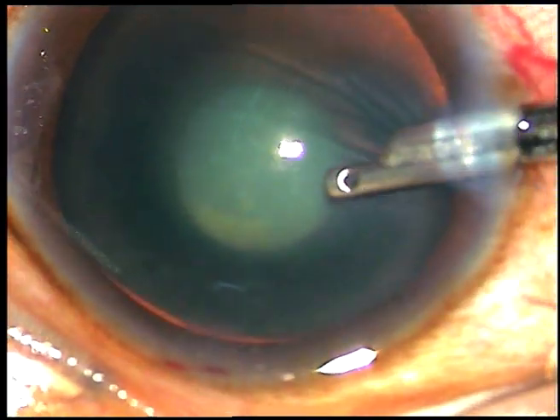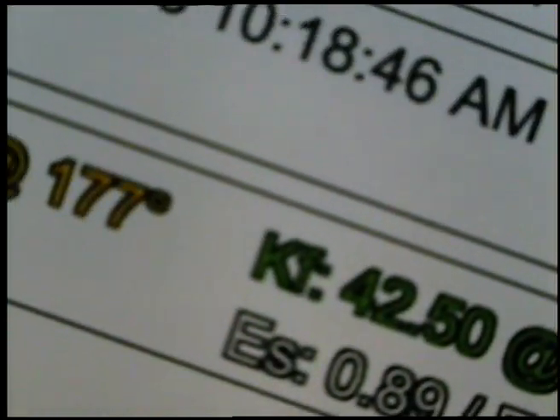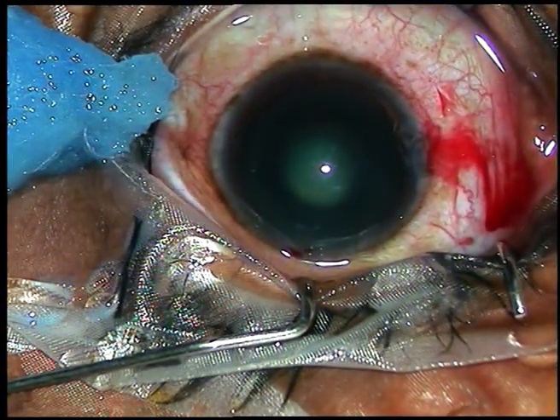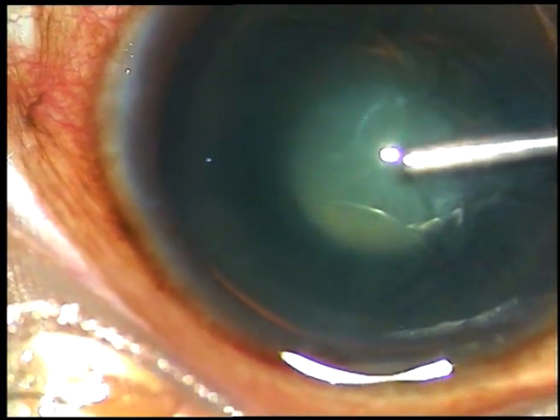In a very short time we are going to see the corneal topography readings. Here it is. You can see this patient has astigmatism of 4.35 diopters — these are the K readings. The steep axis Ks is at 177 degrees, so the main incision is at 9 o'clock, and I have planned to put a clear full thickness incision at the opposite limbus.